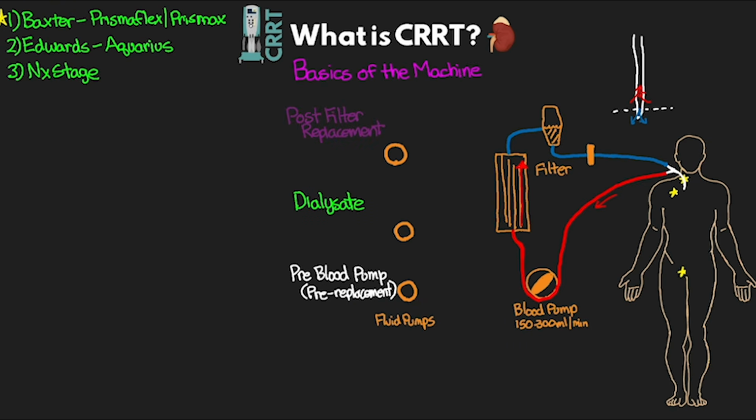So first let's talk about the dialysate here. So this is going to flow with the help of our pump to the top of the filter, and this is going to flow top to bottom in the filter on the outside of those hollow fibers carrying the blood.